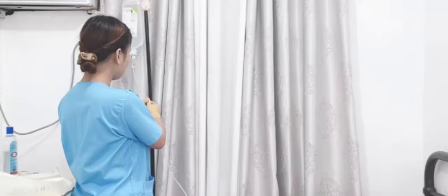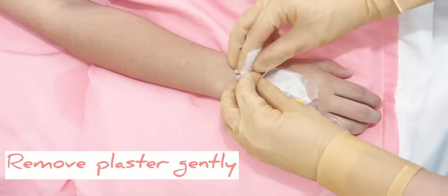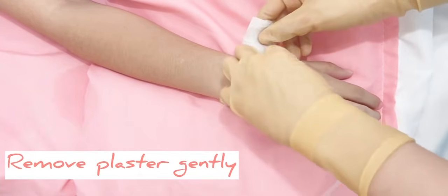Then close IV clamp of IV tubing. It prevents spillage of IV fluid. Then remove plaster gently.